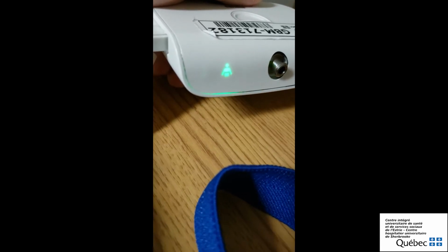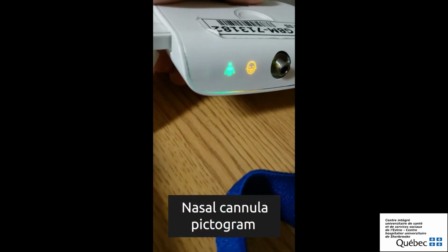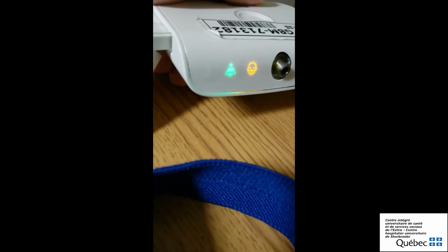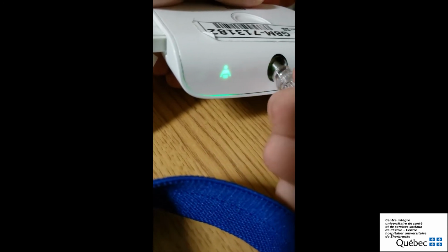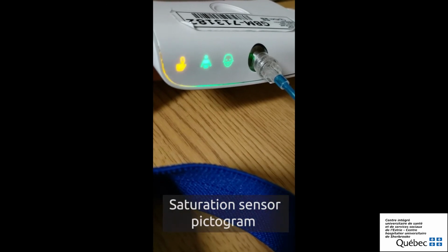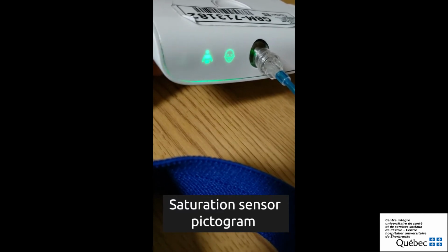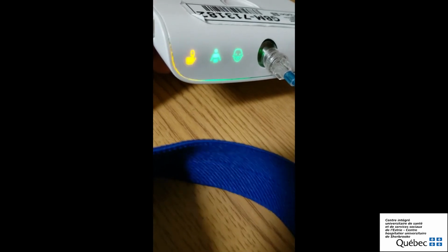If we look beside, we can see a face with a line on it. This line signifies the nasal cannula. When it flashes yellow, it means that the machine isn't picking up the air coming from the cannula. You can connect the cannula here, and the light will become green when the machine feels the air through the cannula. The last light we see flashing yellow is the saturation sensor on a finger. It is a saturation monitor to see your oxygen levels. When the saturation sensor is well positioned, the light will be green.